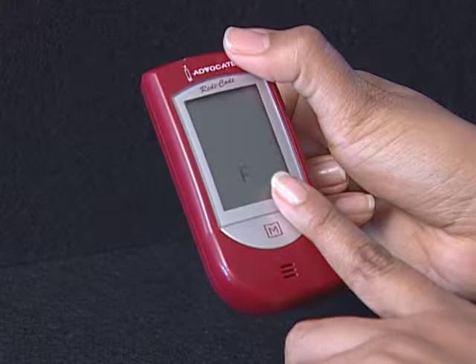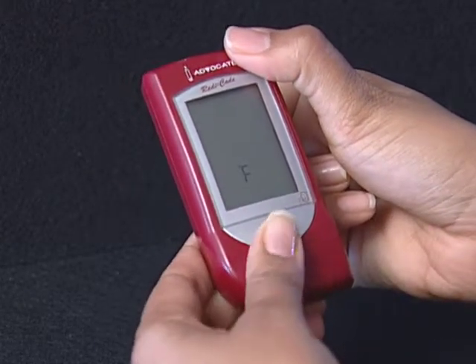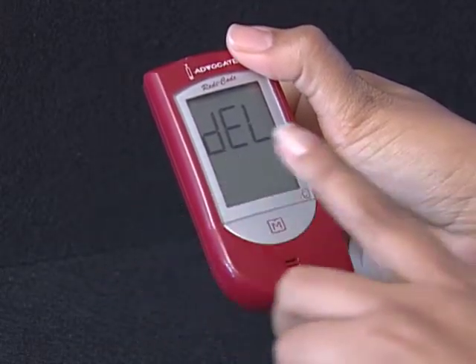Step 7: Select C degrees for centigrade or F degrees for Fahrenheit. Press and release the M button to select the unit of temperature you want to use. Press the Set button and the meter will display DEL with the flashing M symbol.